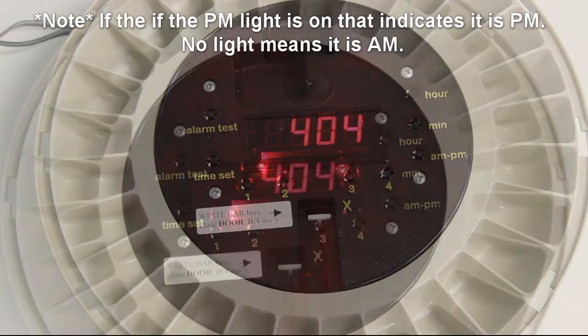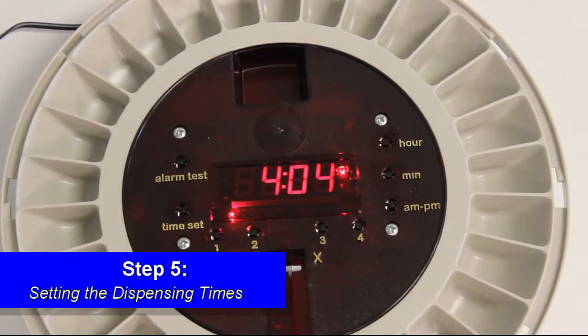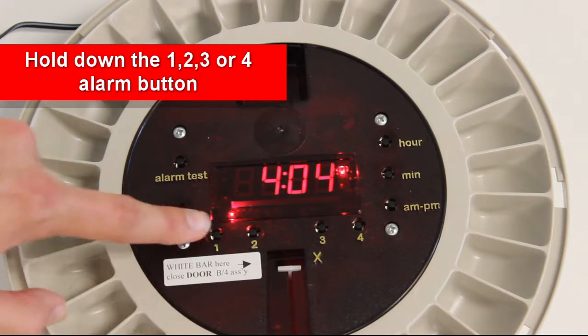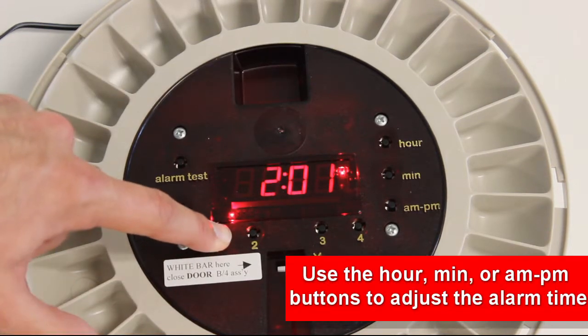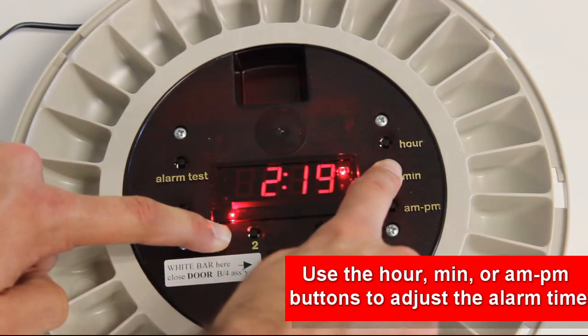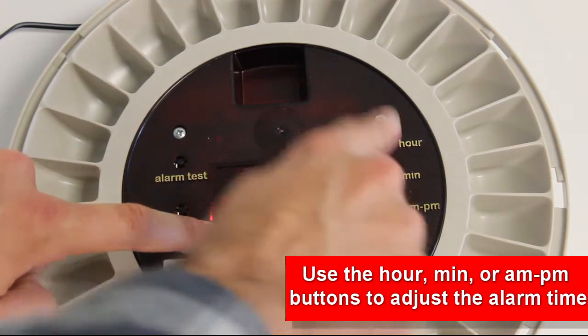Step 5: Setting the dispensing time. Hold down the 1, 2, 3, or 4 button. Then use the hour, minute, or AM/PM button to adjust the alarm time. Release the buttons to set the time.